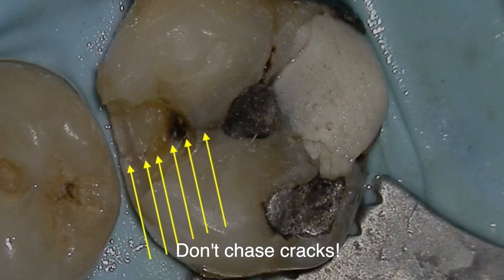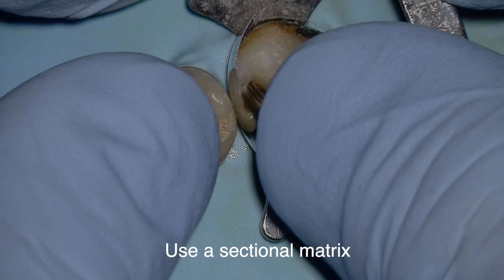Tip number six: don't chase cracks. That crack is likely 25 to 50 percent deeper than you can see, so the best approach is to leave it, restore it, and prepare the patient for a potential full-cusp restoration.